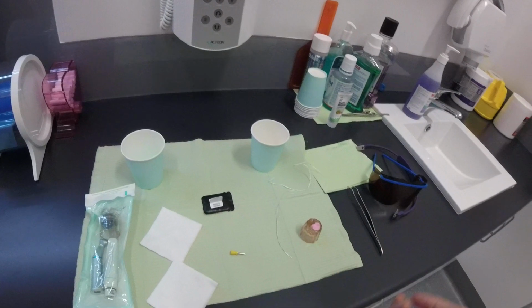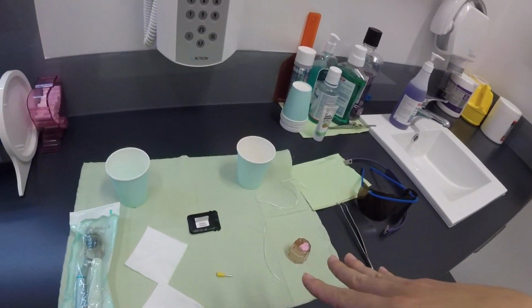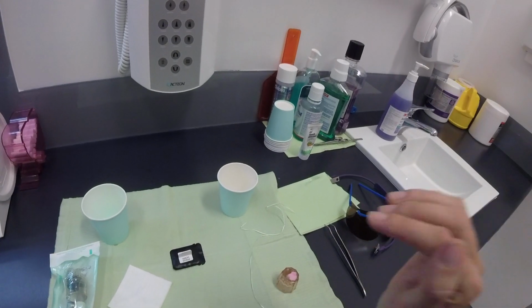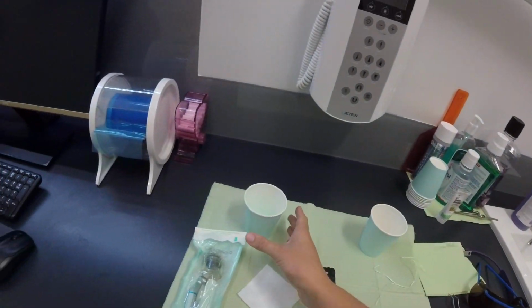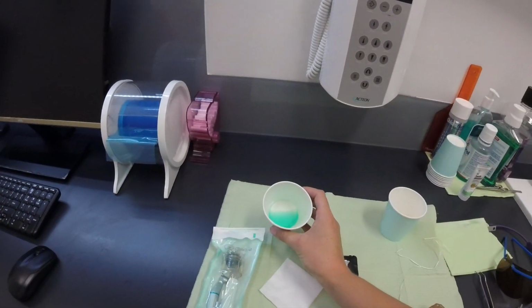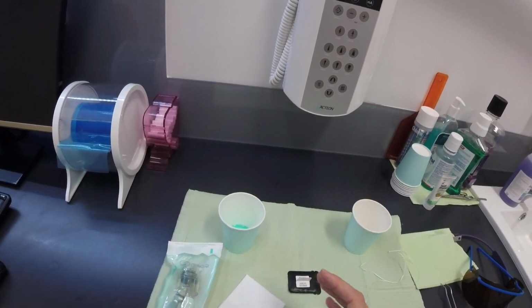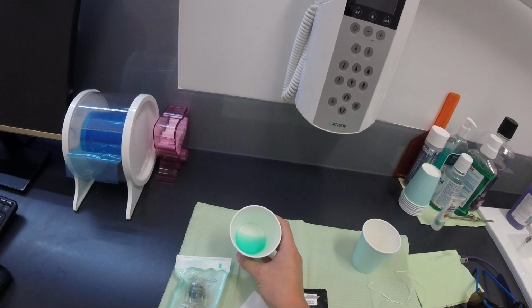So I usually say, there's a cup to the side there, have a good rinse, try to get any of that gritty stuff out. And then when you're finished, I will give you the fluoride, which is the next one. Now, some patients say no, they don't want it, but that's fine. They can say no, but we always offer the fluoride.